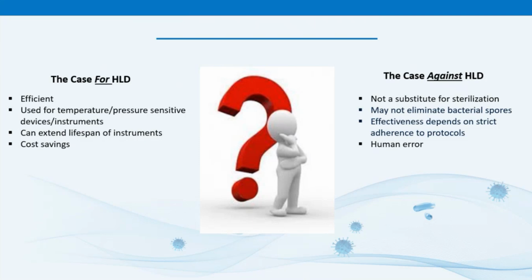Now, the AAMI ST91 Standard Committee knows that transitioning from HLD to sterilization as the standard of care is going to take some time. Endoscope and sterilization manufacturers are going to need to design and implement the necessary device changes needed, and healthcare facilities will need time to budget and make some accommodations to implement this change. Now, the standard doesn't mandate sterilization, but it recommends healthcare facilities begin making the necessary steps towards sterilization for flexible endoscopes when possible. This change in processing of these scopes should be on your radar.